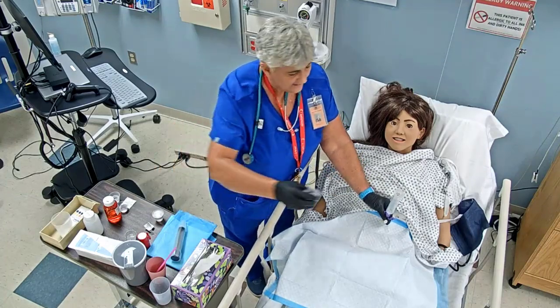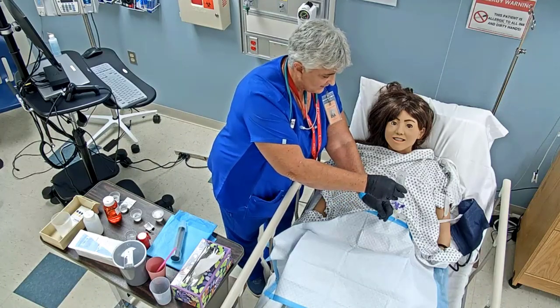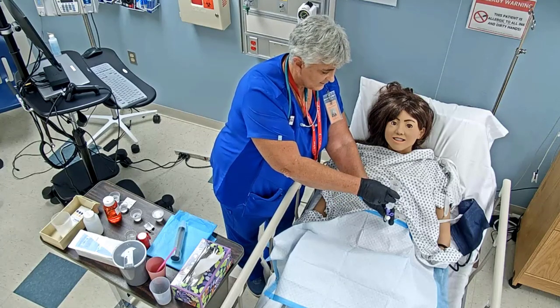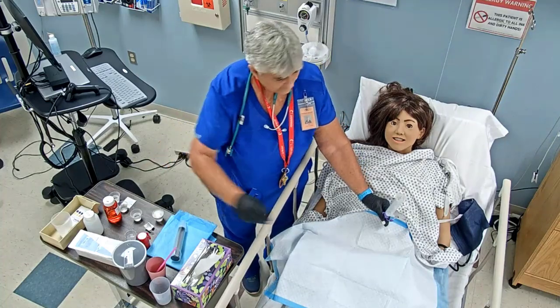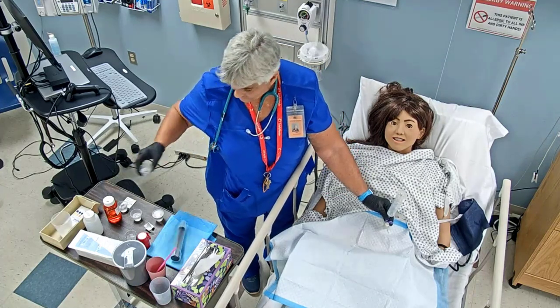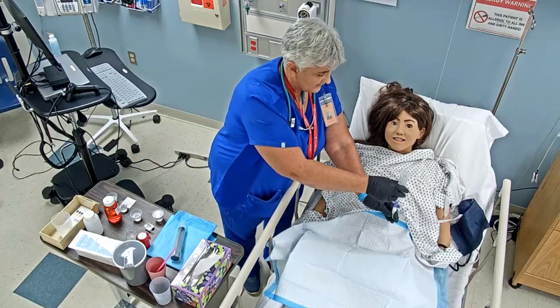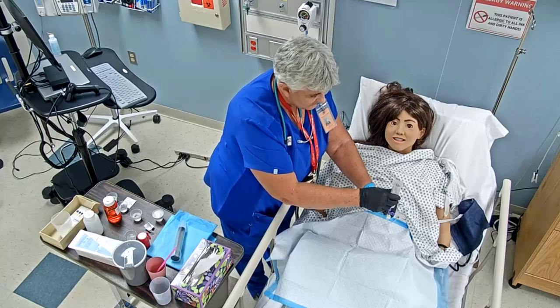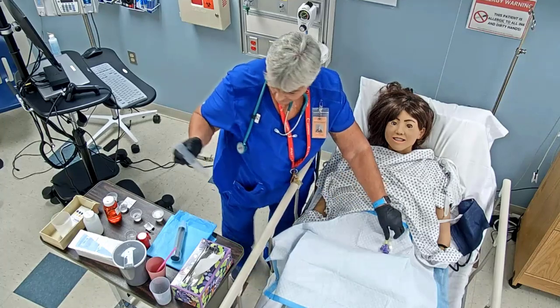I need to irrigate or do 15 of the sterile water, so we're going to do the 15 to flush in between. And this whole time I was making sure it wasn't clogged, but obviously it's not because it's going by gravity. Okay, once that's in, then I'm going to get my Pepcid, pour that in, unclamp, let it go by gravity, clamp, get my last 15 of sterile water, pour it in there, and then let it go by gravity. Okay, once that's gone by gravity, we're going to clamp that, take that off, and put our cap back on it.